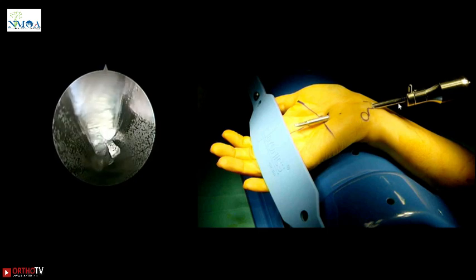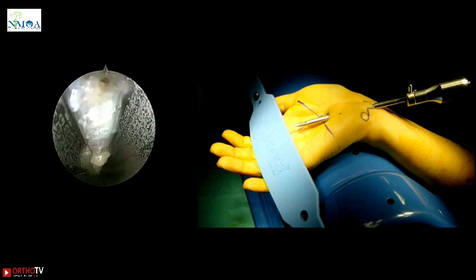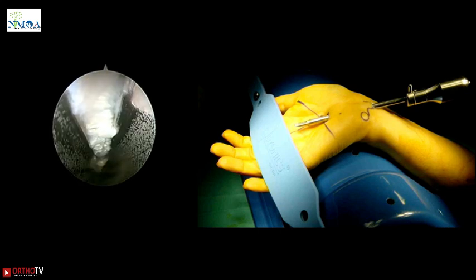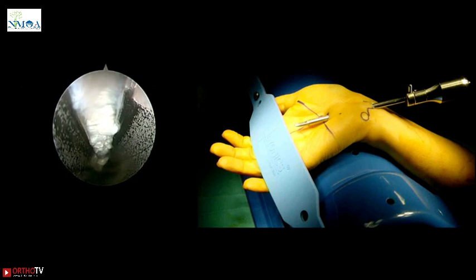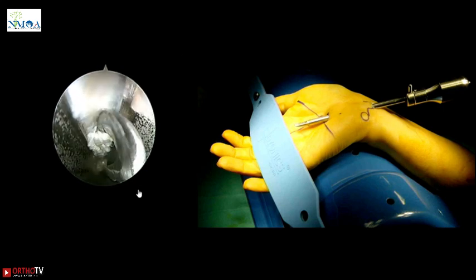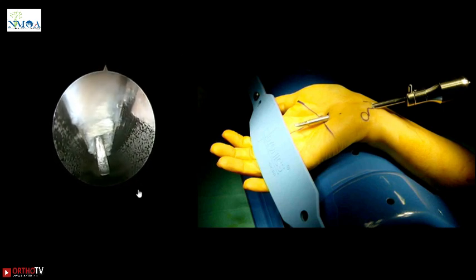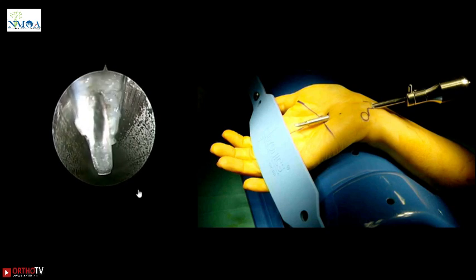This cannula is very small, 4.5 mm diameter. The blue ones, the commercially available, which I used to use earlier, were very big, almost 5.5 to 6 mm diameter. So there are various knives used. The first knife is a pointed knife. After that, the second knife, which is a reverse cutting knife, with which we cut the carpal tunnel in a retrograde fashion.